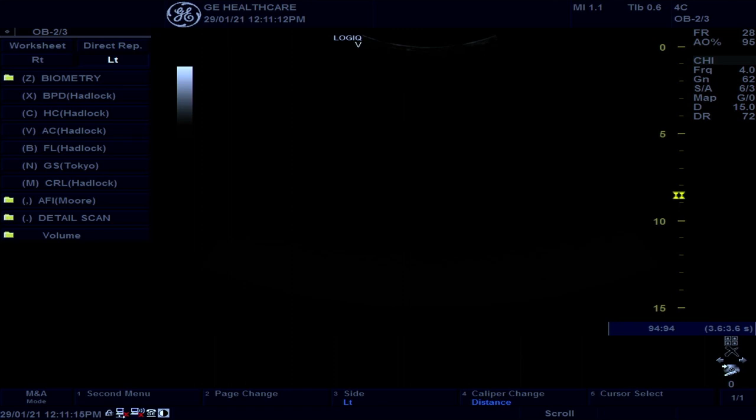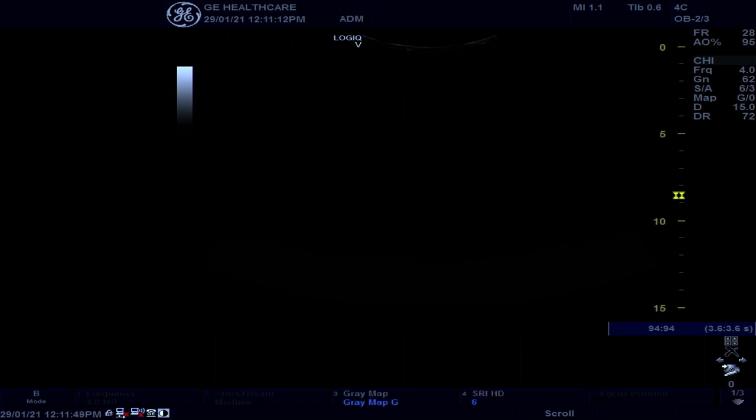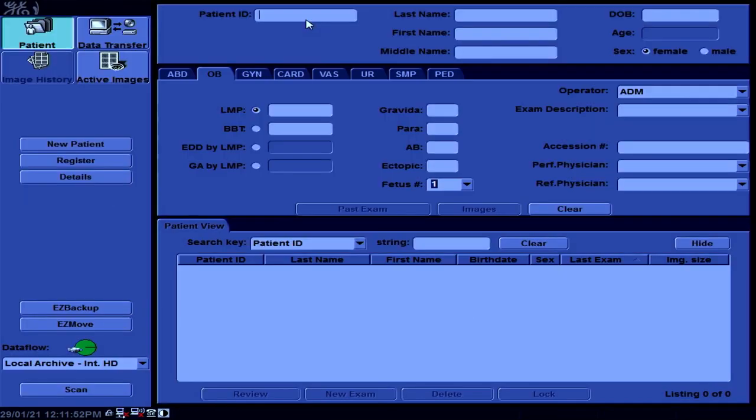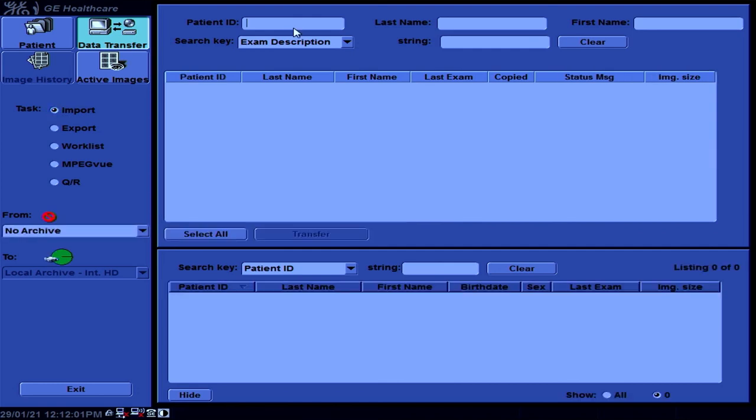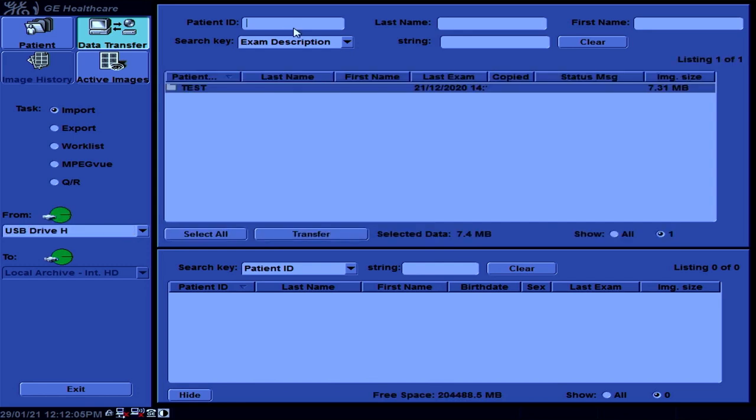Once we're back in the scanning area, we can proceed with importing the patient data that we exported previously. We go into patient, data transfer, import. Choose our media and select the patient that we want. And click transfer.